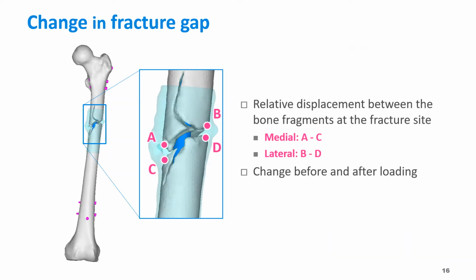To evaluate the movement between the bone fragments, we measure the change in distance between the bone fragments before and after loading on the medial and lateral side.